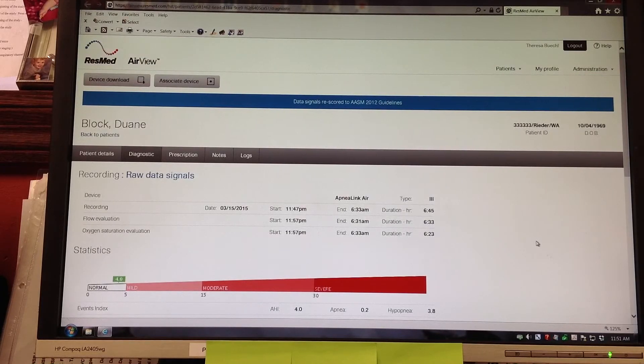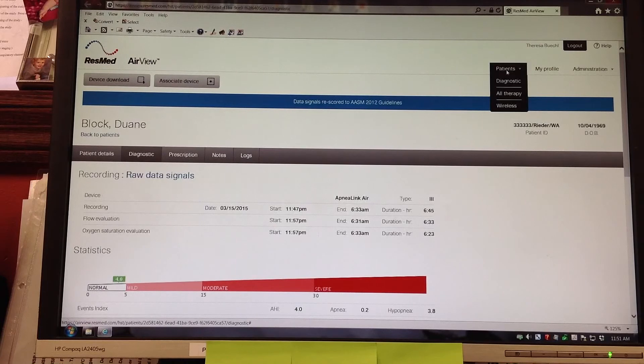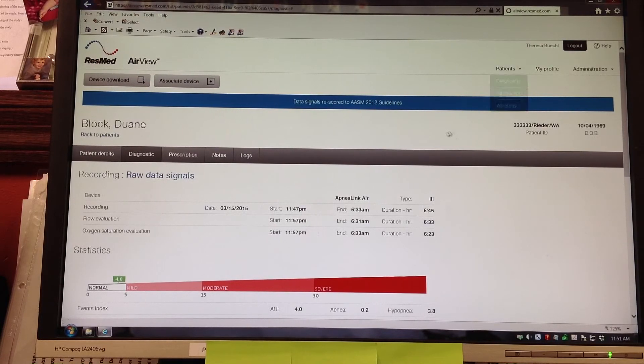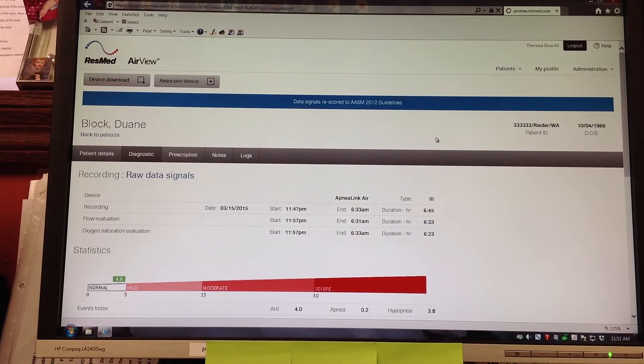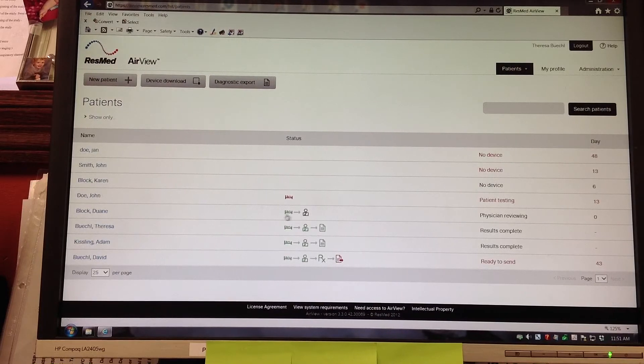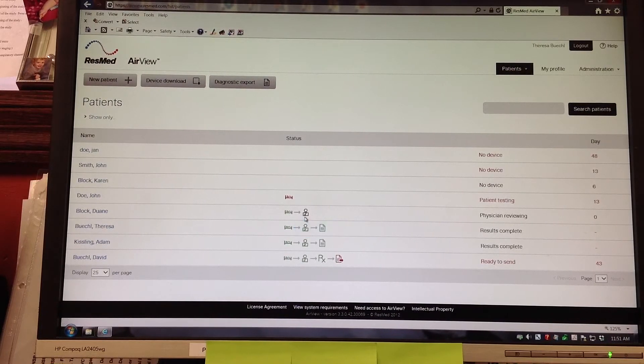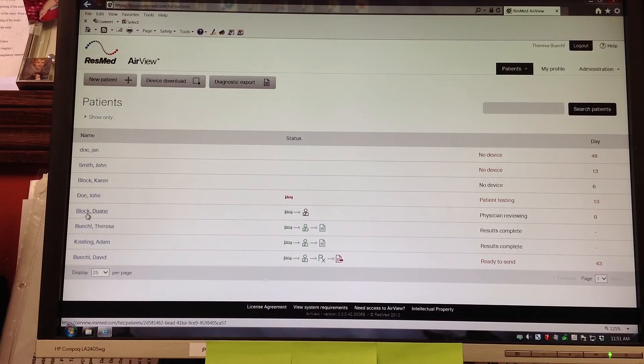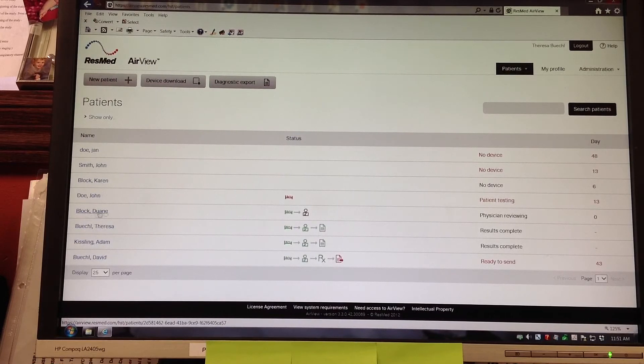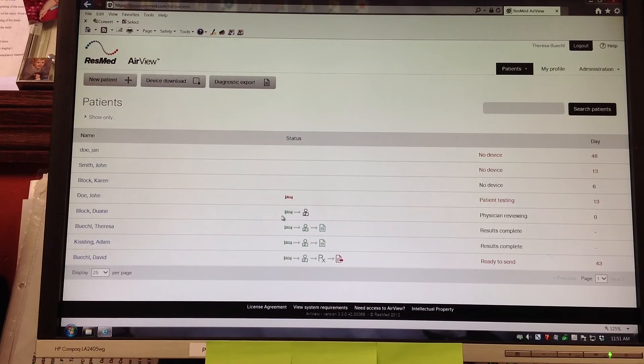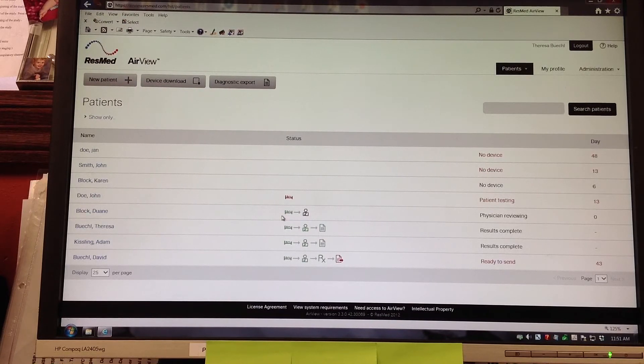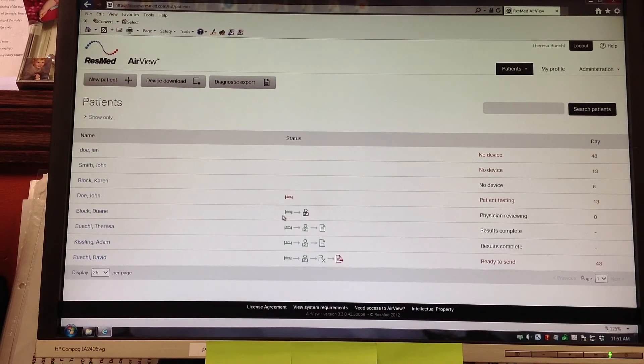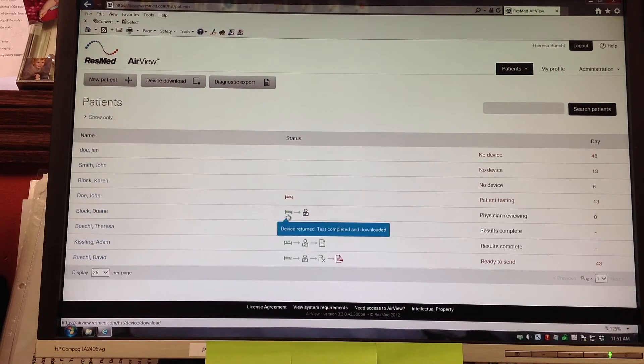We can go back up to patients. We go to diagnostics and I want to show you the patient dashboard. We are going to look for Dwayne Block's name. I am going to scroll over to the left where his name is, and then move over to the right and we are going to look underneath the status area. When we set the device out on Dwayne you were given a black icon of a person in a bed. That has now gone to green because the test was completed.